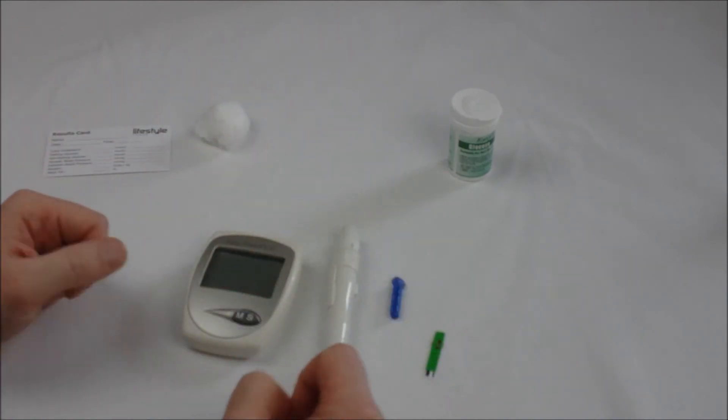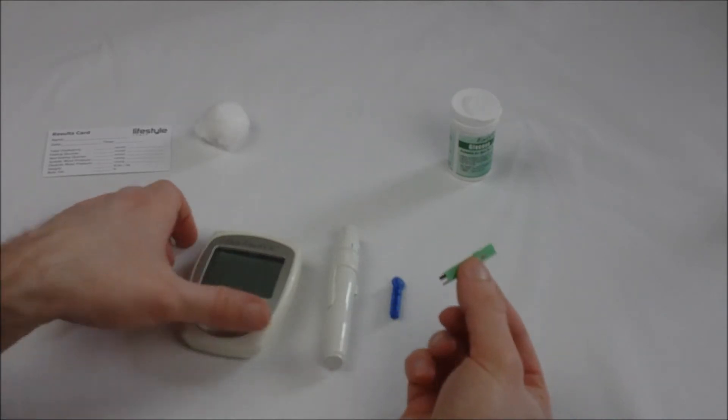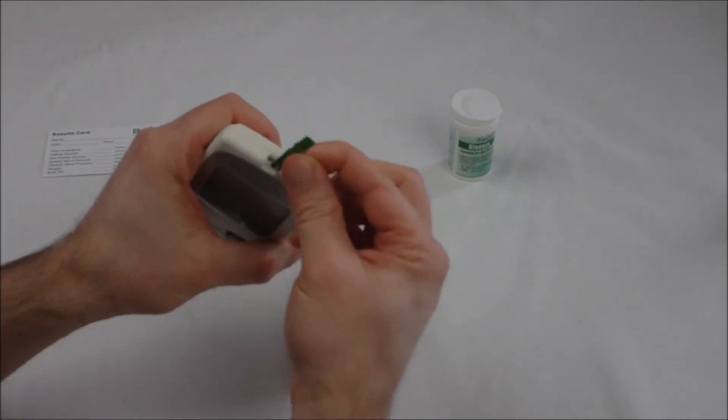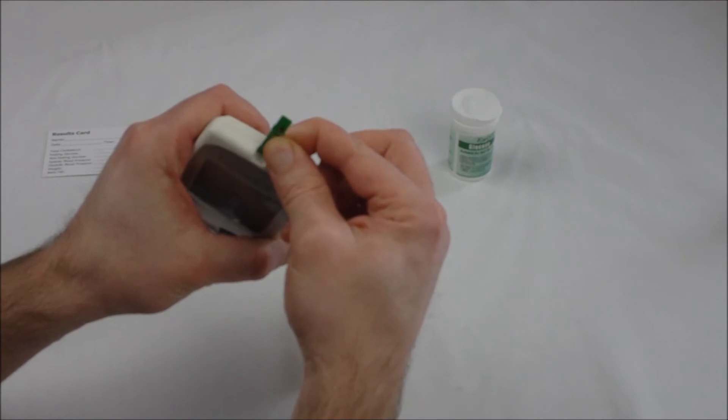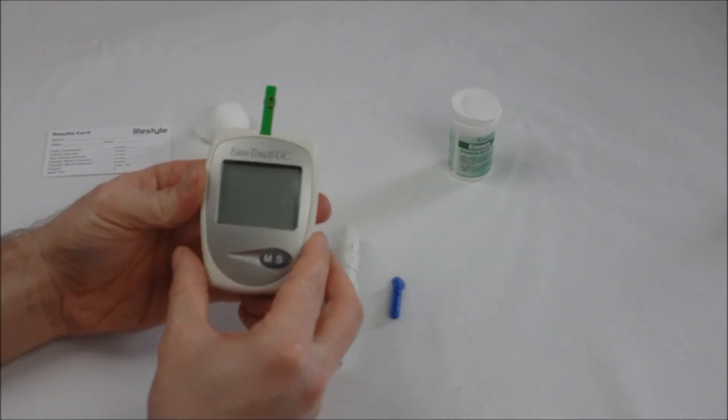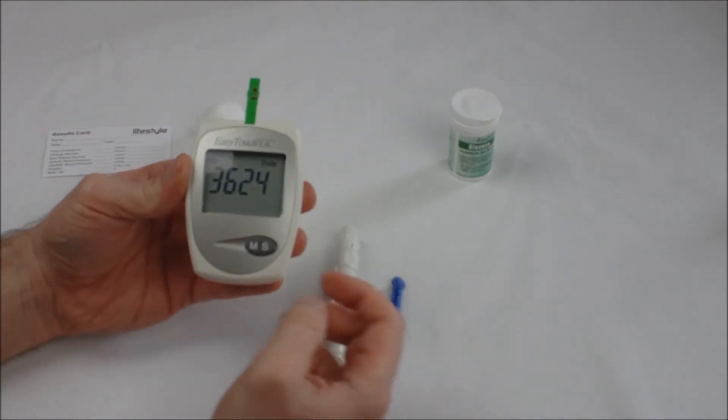Take your test strip and insert the barcode end into the slot at the top center of the monitor. This will spring the monitor into life and will flash a number.